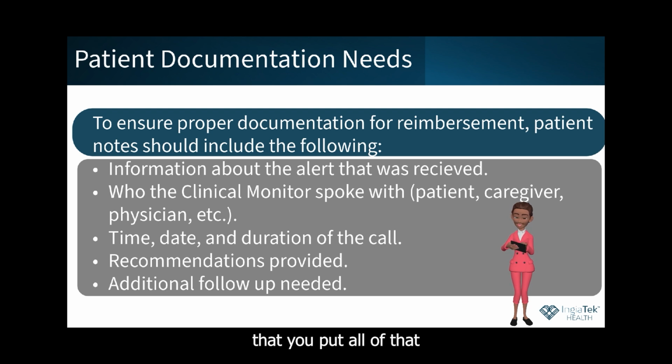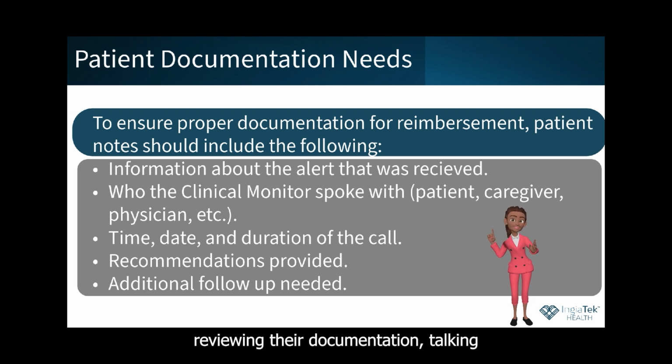You want to make sure that you put all of that information in writing because, as we've talked about in the billing training, you're able to bill for 20 minutes of time that you have spent working with the individual, reviewing their documentation, talking to the individual, making those recommendations, calling their physician, whatever it is that you're doing related to the data collected from the IngiaTek provider dashboard. It's all billable. And you want to make sure that you have the correct documentation to align with that billing.